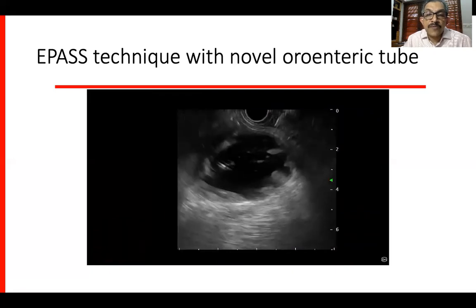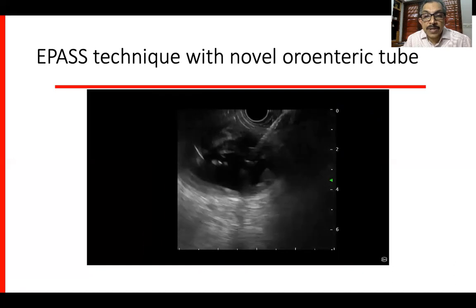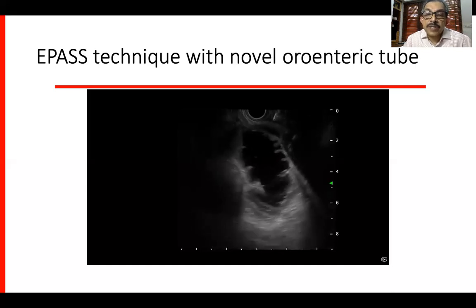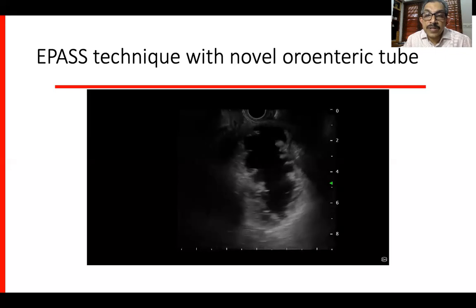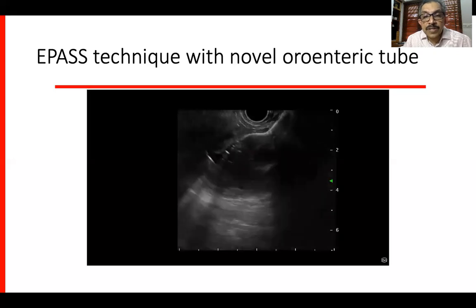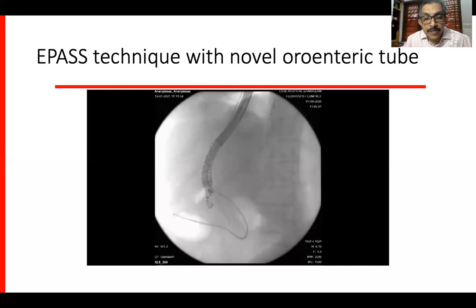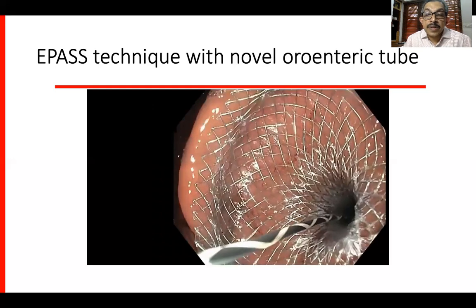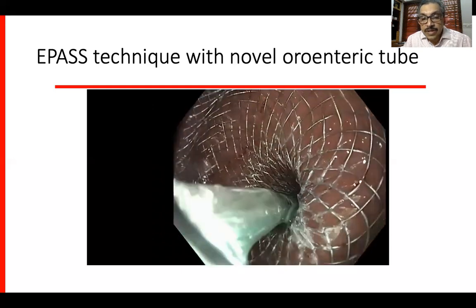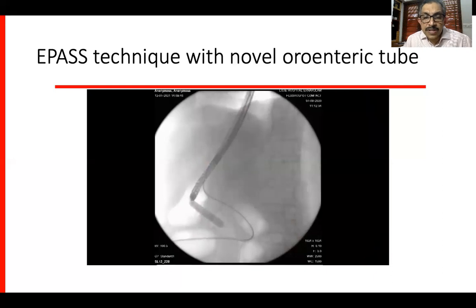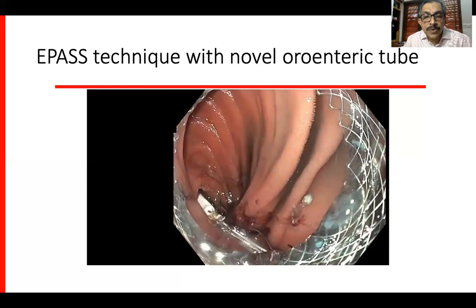Once the distended loop of bowel is located, it is punctured with the EC-LAMS assembly. In another patient, you can see the distended loop — it looks good and can be punctured. Once punctured, the distal flange is deployed and the assembly is withdrawn, then the proximal flange is deployed. You can see the gushing out of fluid after deployment. We usually dilate with a CRE balloon to about 12 mm and never more than that; some operators prefer not to dilate at all.